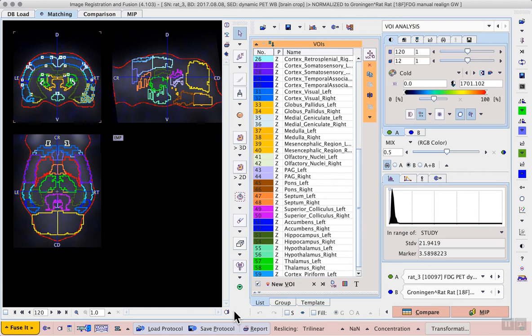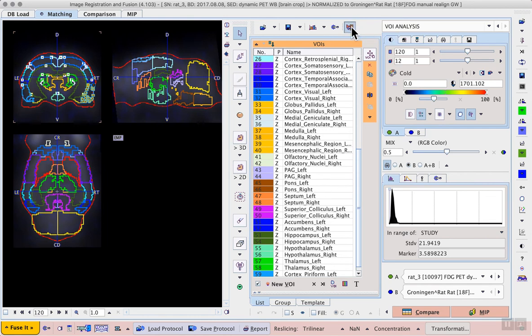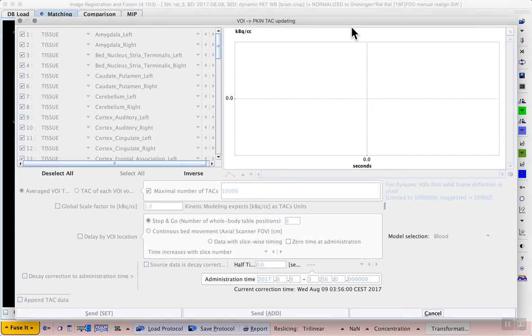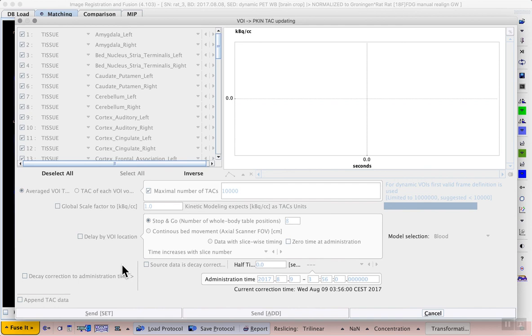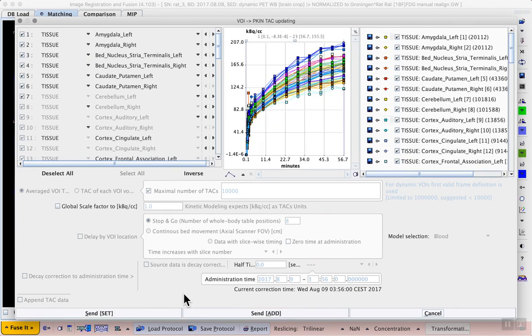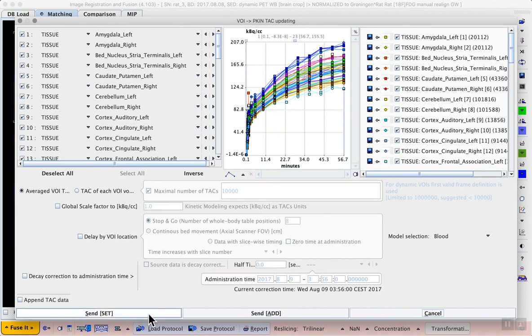This allows us to calculate our time activity curves. There are two options for convenient transfer of the time activity curve from each VOI to the kinetic modeling tool. When you proceed directly with the modeling, the kinetic modeling button to the right of the statistics options calculates the curves and allows direct transfer into the kinetic modeling tool. Because we have many VOIs and 23 time points per VOI, we require some processing time. Then the send buttons become active for sending the data to the kinetic modeling tool.